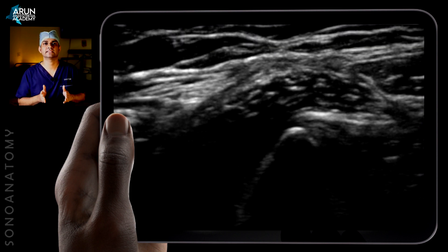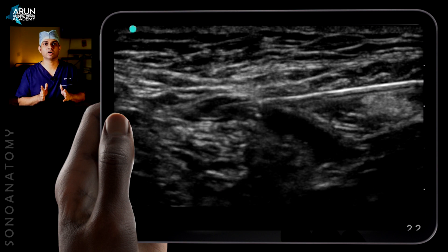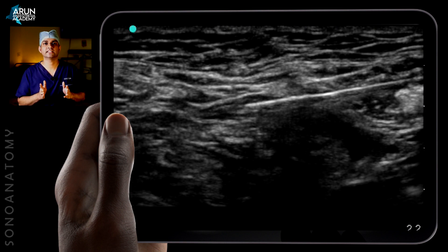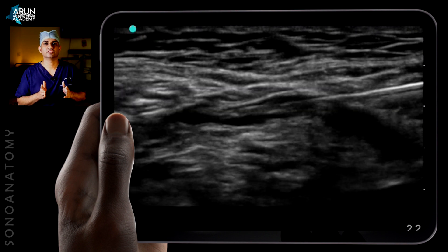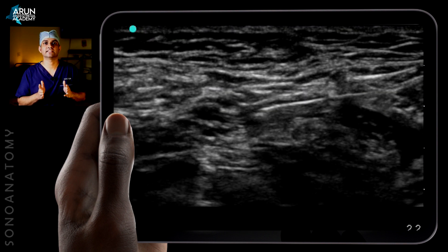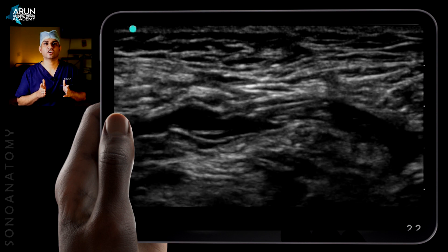The deep circumflex iliac vessels are very important. In the classic description of ultrasound-guided suprainguinal fascia iliaca block, the needle should reach the fascia iliaca compartment at a point near the deep circumflex iliac vessels. When injecting, we should see the deep circumflex iliac vessel and the fascia iliaca above the drug-depositing region and the iliacus muscle below. If you are not in the correct plane, the drug may go intramuscular or above the fascia iliaca. Keeping the deep circumflex iliac vessel in view helps confirm correct placement — if drug comes near these vessels, you are above the fascia iliaca.